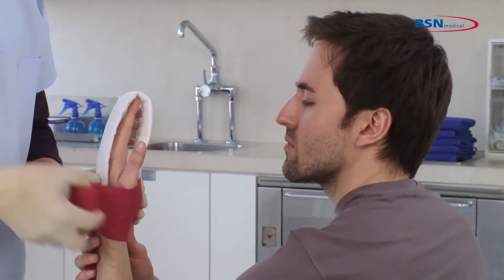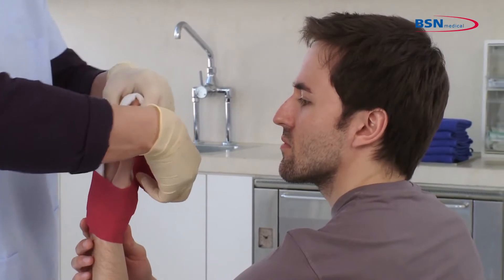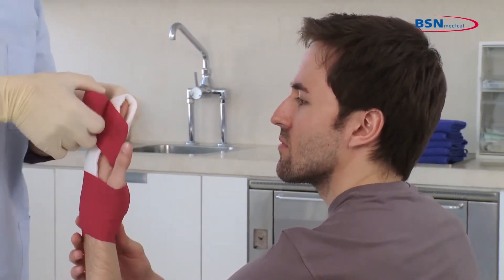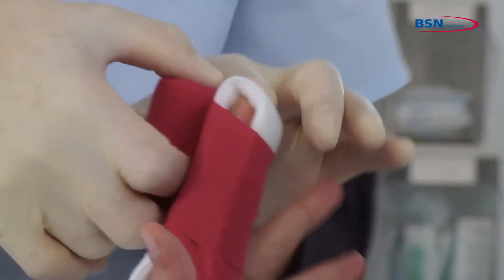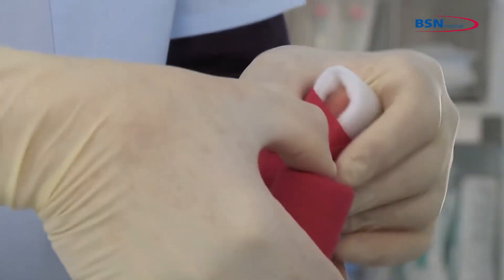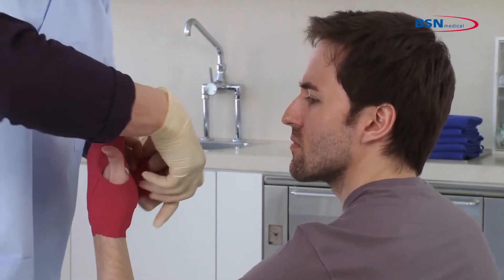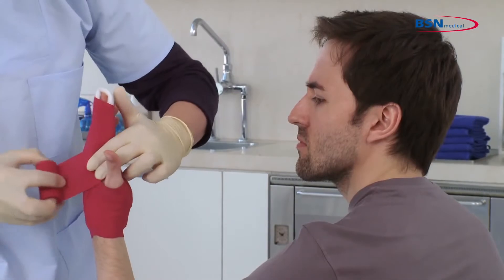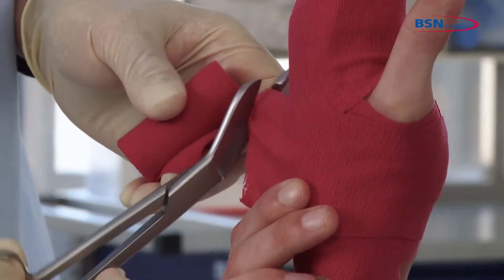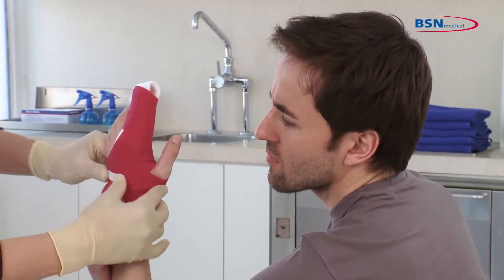To get the right immobilization, go up the hand and through the web space of the thumb and index finger. Wrap around the injured finger twice and go down again through the web space. Fixate the bandage at the patient's wrist with a tape or hook and loop fastener.